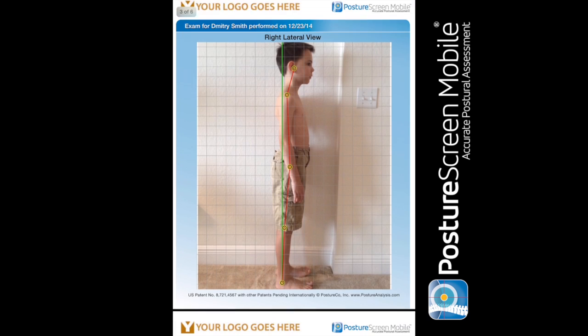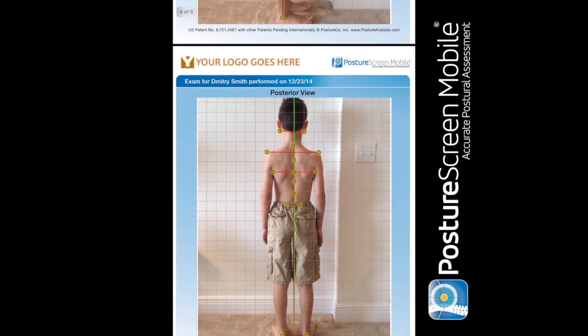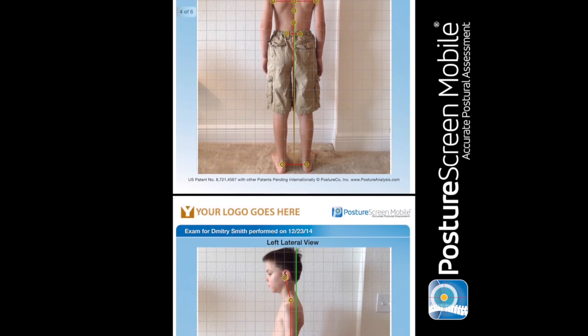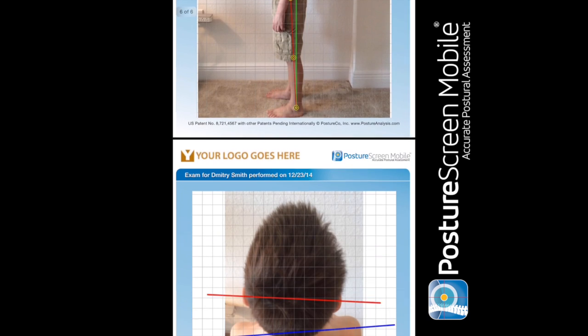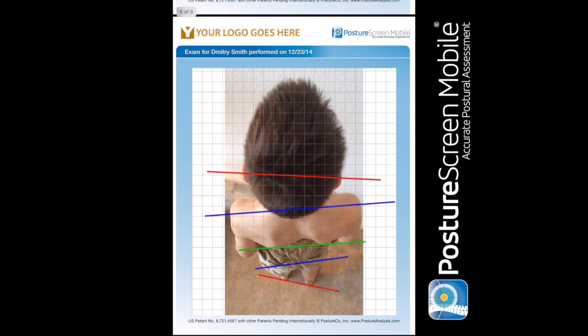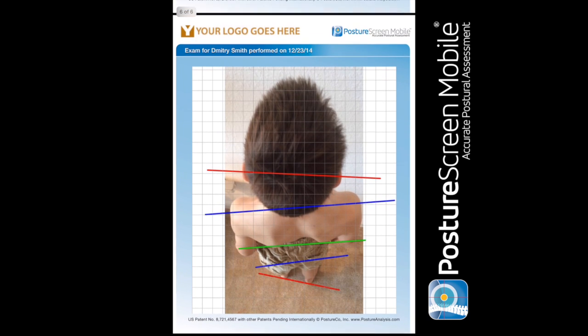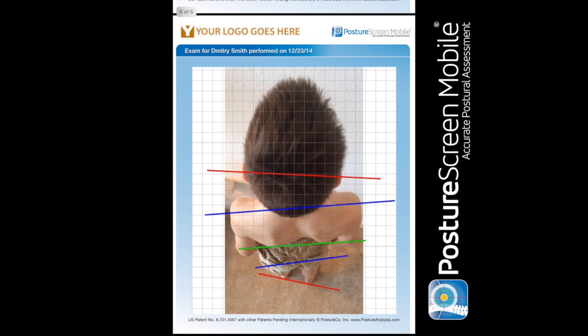So that's how to measure and objectively document axial rotation using posture screen mobile. For more information, reach out to us at support at posturescreen.com. Thanks.